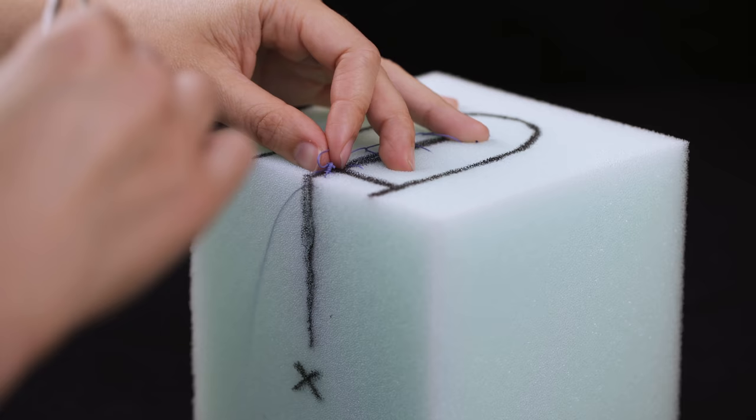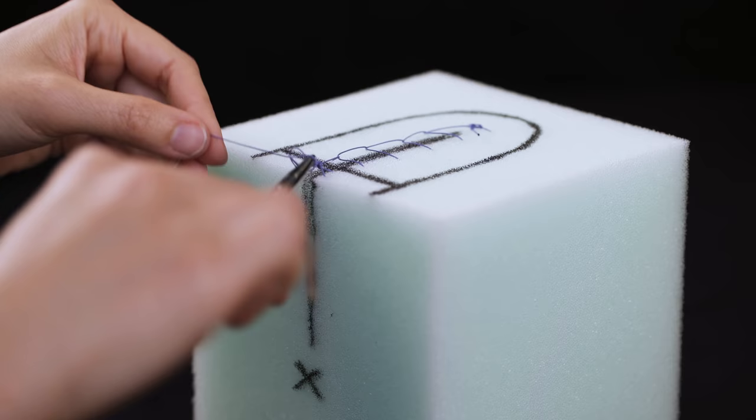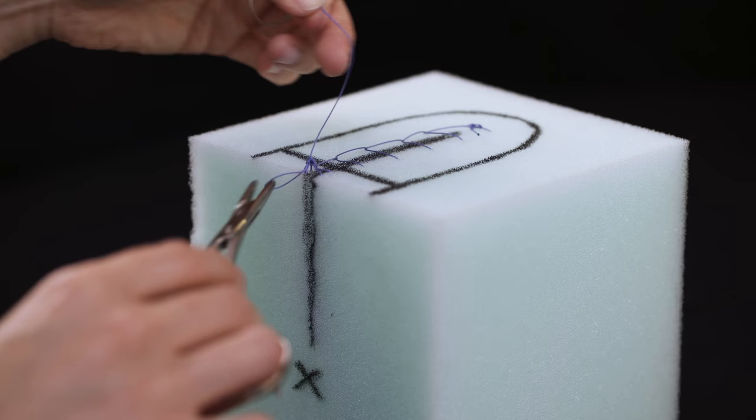When I reach the top, I can tie my suture to the end I left from the vaginal layer. I cut the suture tail pretty short at about 2 millimeters. If it's too long, it's uncomfortable for the patient.